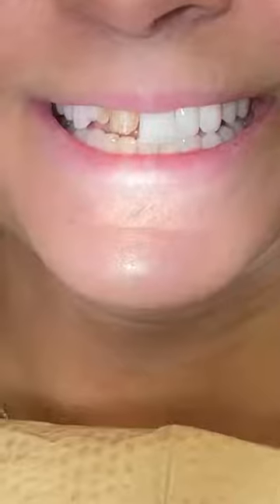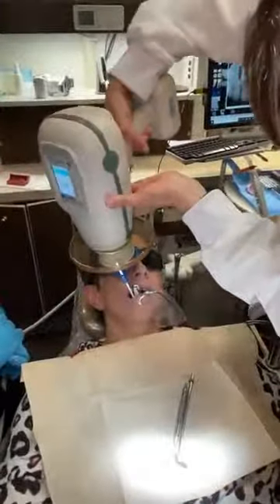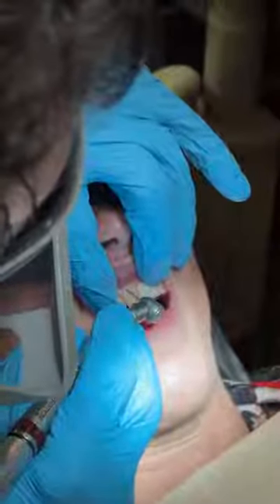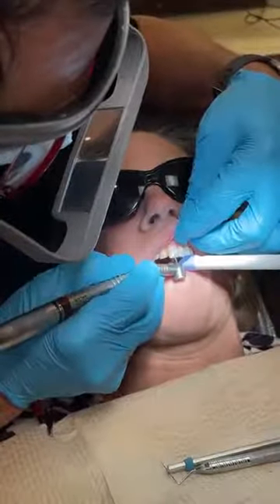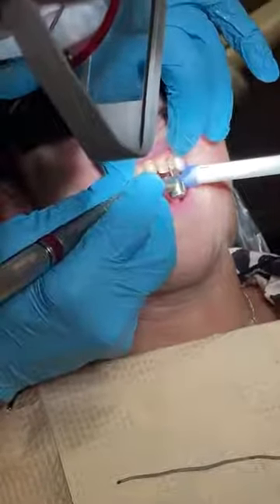So this is our beginning video of Nicole. You can see she obviously damaged her teeth. In fact, she damaged 4 of the 4 front teeth. So we took x-rays so we could make sure that she still had good bone and good root structure. And then we had to grind off the jagged edges and the broken pieces of what she had left of her teeth. And once we get all of those off, then we need to examine that and make sure that they're healthy. And it takes a little while to grind that stuff off.